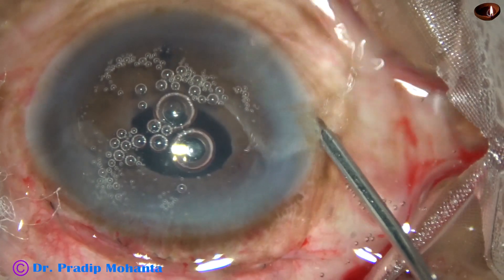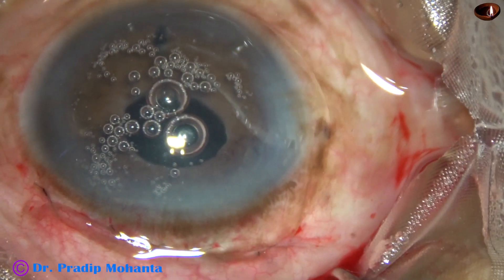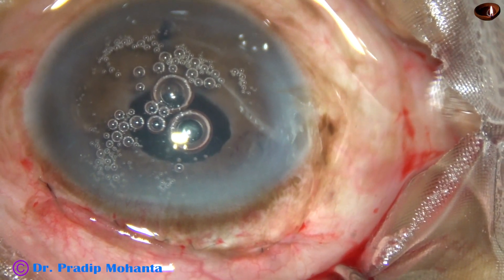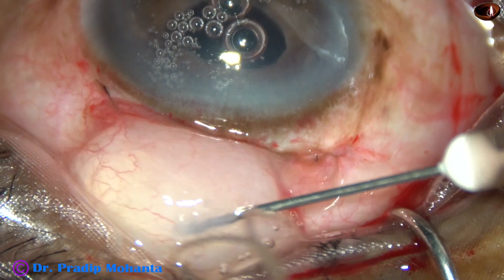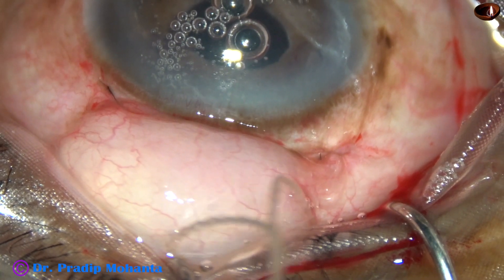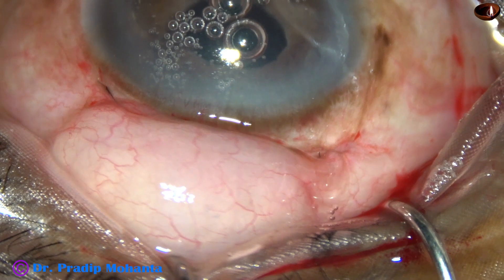Now I check the pressure — it was low — so I inject some more BSS. And now this is dexamethasone. The superior rectus bridal suture is removed, and the case is concluded.